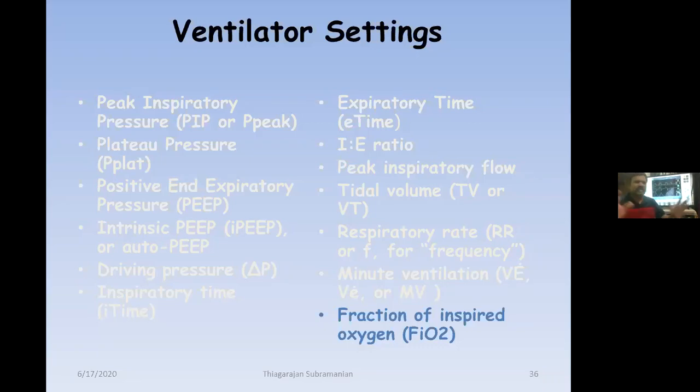It is just a basic, very brief idea. We can adjust the FiO2 before and after your postural drainage technique, so all these things are important. Moreover, ventilator-acquired pneumonia prevention is very important, but that is a different area that we will discuss in a future session.